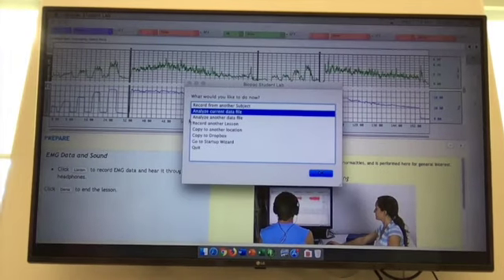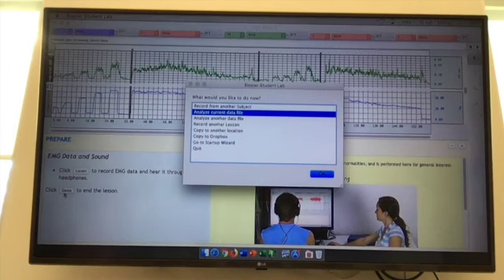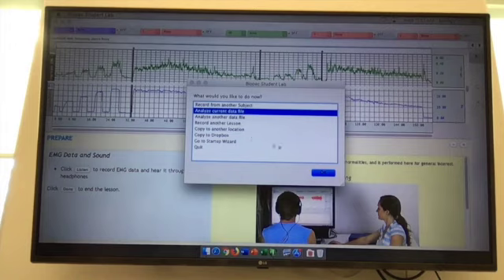Okay, so once you're all done, you will be able to hit done for the lesson because we're not doing the sound part. We can't use the headphones. And then we can go and analyze current data file, or you can save it to the computer to analyze it later. But if you're in the lab, you'll be doing this. At home, I'm going to give you some example data, and you'll be able to actually do this next part on your own.